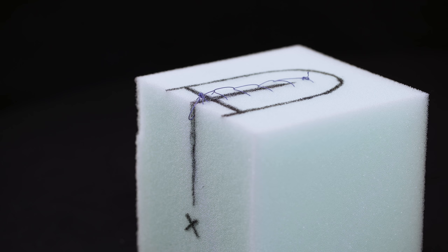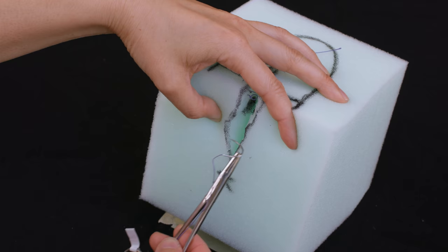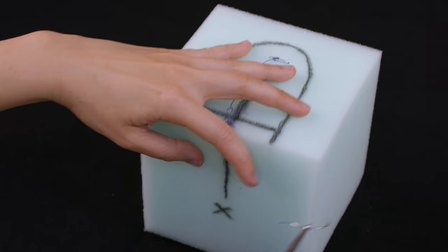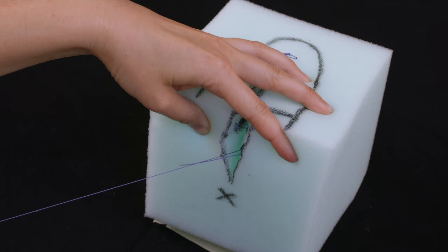Then, I'll insert my finger into the dead space to get a sense of how deep it is. For the remaining interrupted deep sutures, it's important to remember the proximity of the rectum. To protect it, you should keep the plane of your needle horizontal so that the movement of your needle tip is parallel to the rectum, instead of plunging down into it.